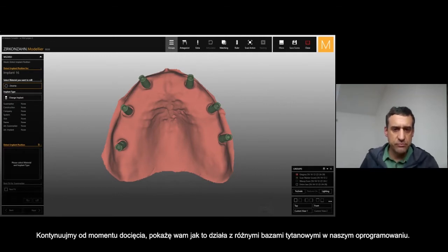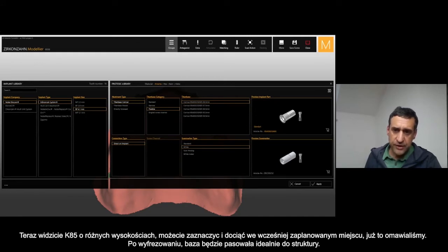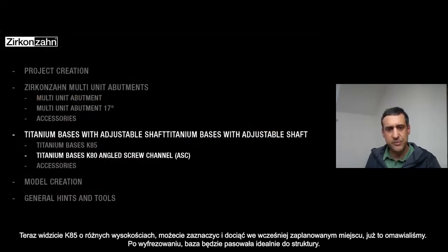Let's continue from the CAD part, but with a different T-base — just to show you in the software. Here you see the K85 with different heights. You can select as I told you before, and then cut at the different height you choose, and it will fit perfectly.